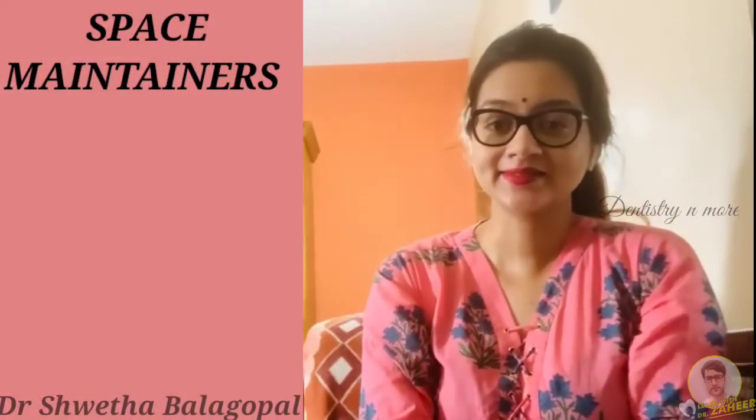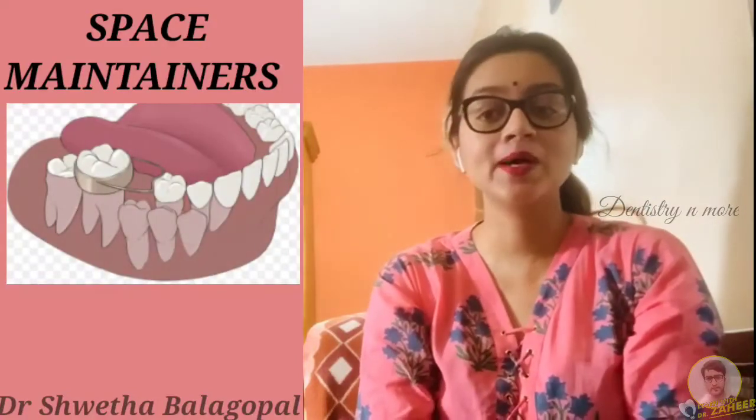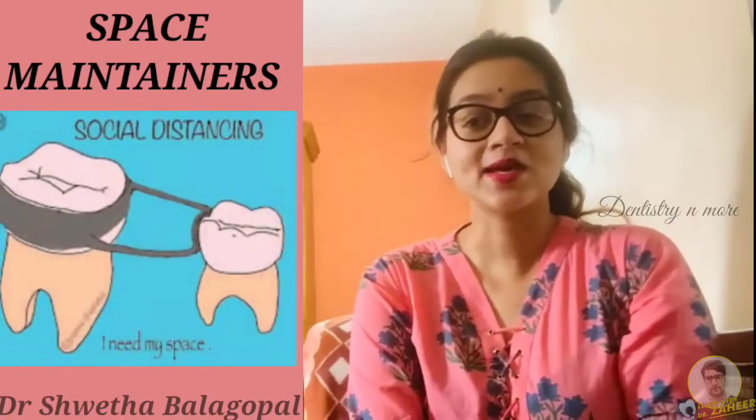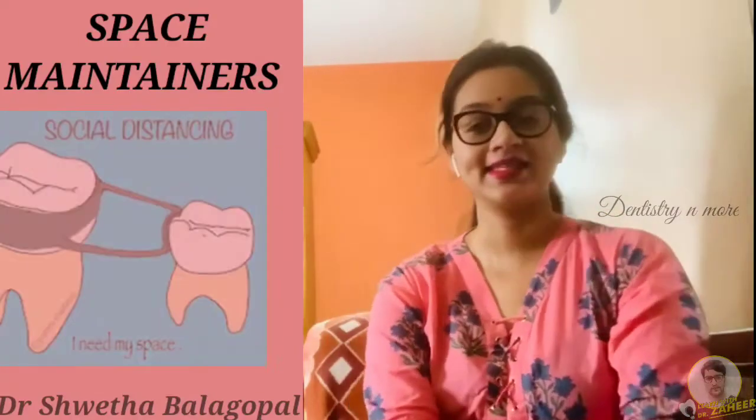Here are three reasons why your child needs to have a space maintainer. Number one, the purpose is to keep the space open and allow the permanent tooth to erupt and come in its place. Number two, space maintainers are very important to prevent orthodontic treatment in the future due to malaligned teeth.